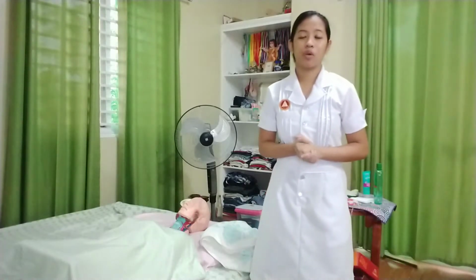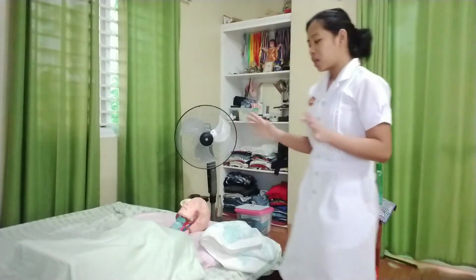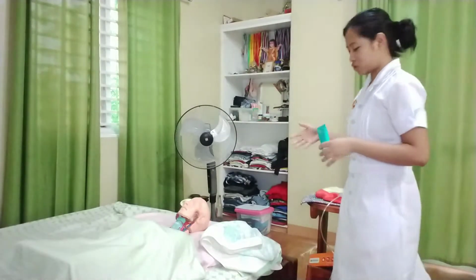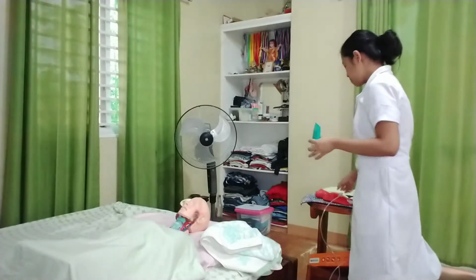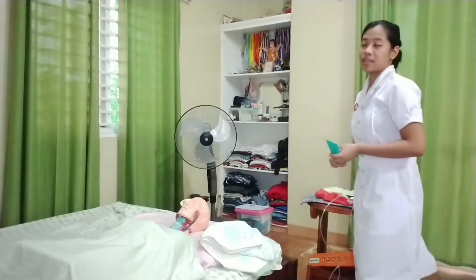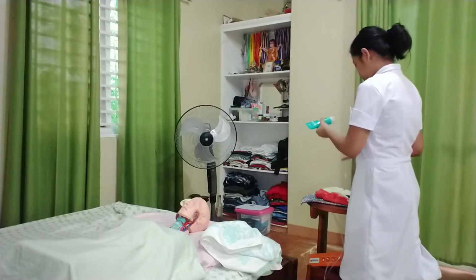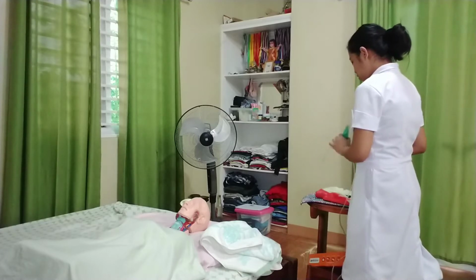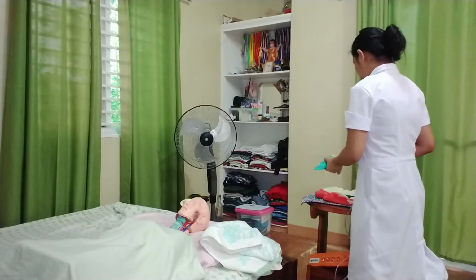After that, I will now proceed to the performance of the procedure. So I will be lubricating about 2 inches of the rectal tube, and also I will be running a small amount of solution through the large volume enema and rectal tubing to expel any air out of the tube. And then after that, I will close the front of the tube. So I will be lubricating it. This is to have a smooth entry of the tube when I insert it in the rectal area.